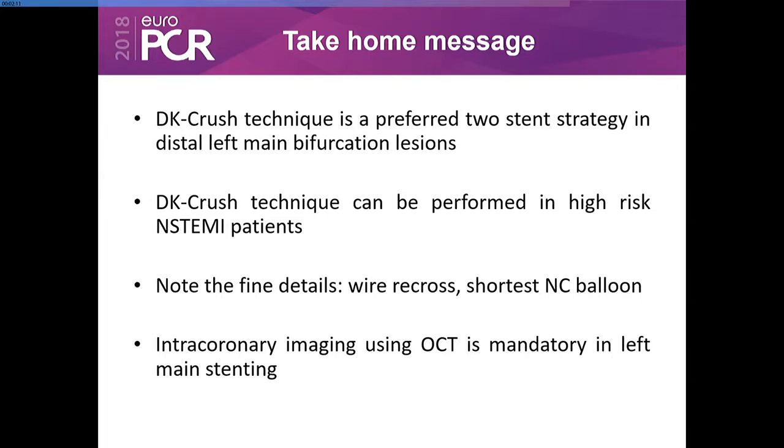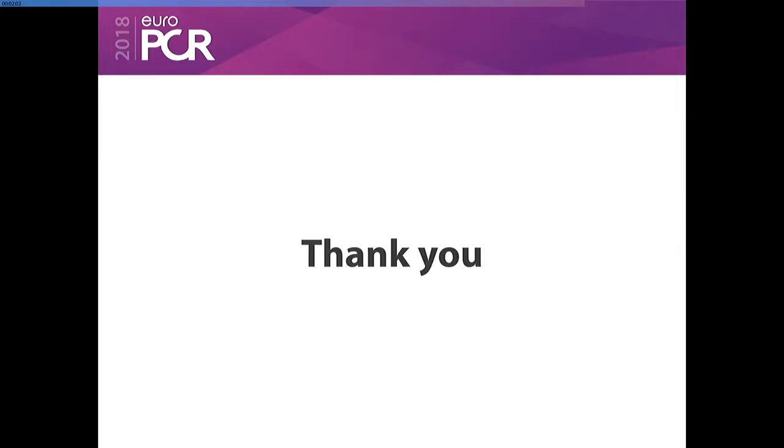And please keep in mind that in the DK crush you have to rewire twice, you have to POT twice, and of course, according to the name, you have to kiss twice. Thank you.